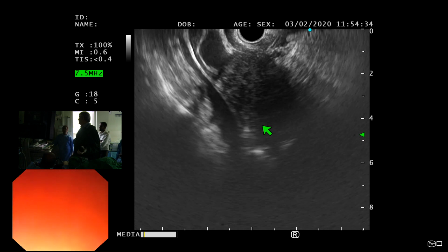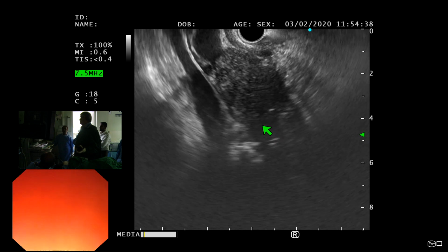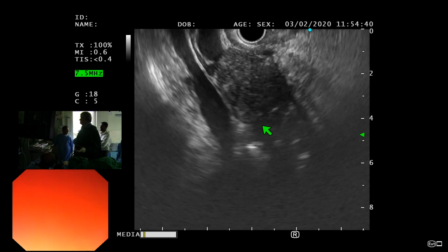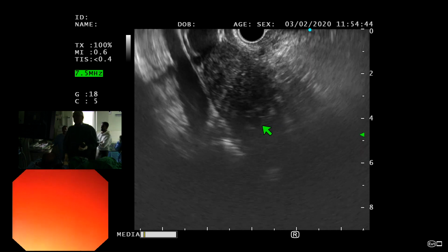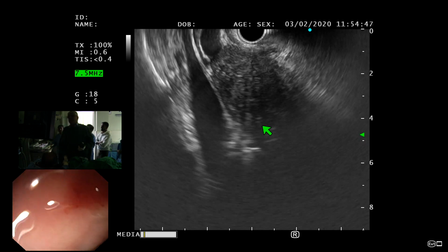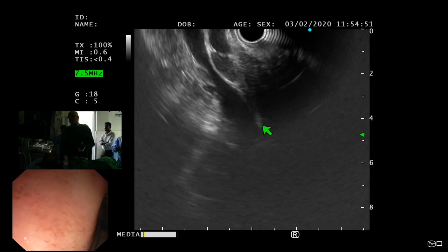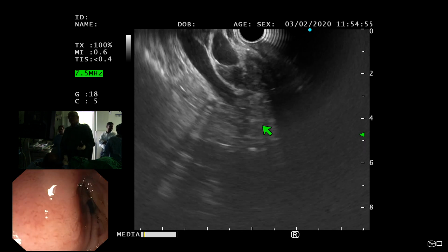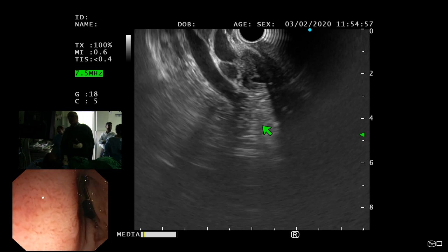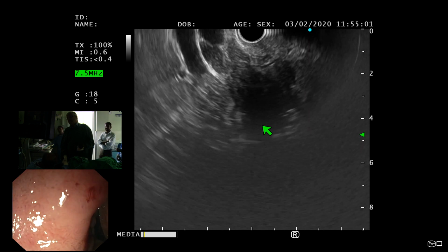So we could biopsy this area. Autoimmune can look like this in this area, but the pancreatic duct would not be that prominent. Yeah, big pancreatic duct, you can see. If I follow this up, that doesn't make sense. I have two systems here. This is coming down literally here, and I can follow it all the way.